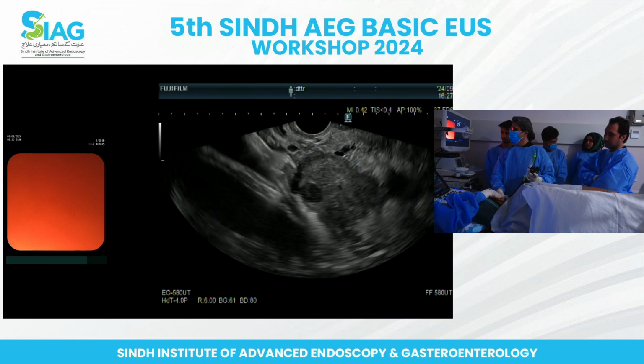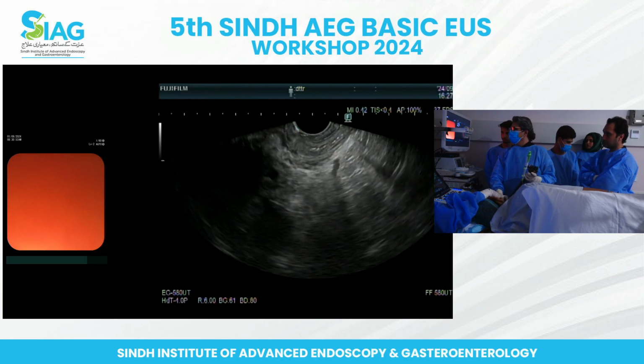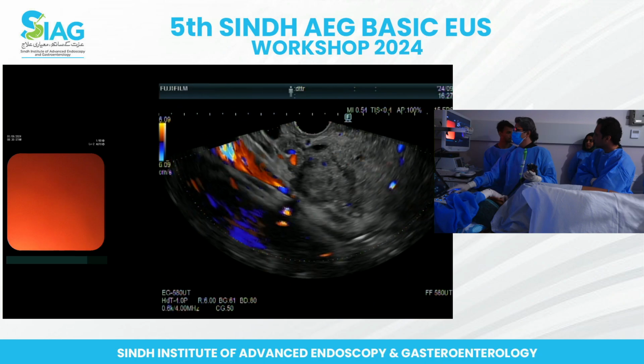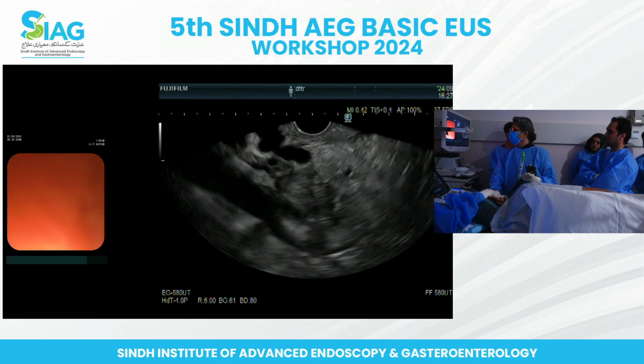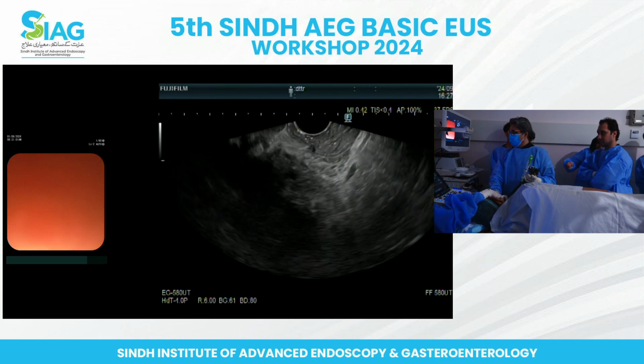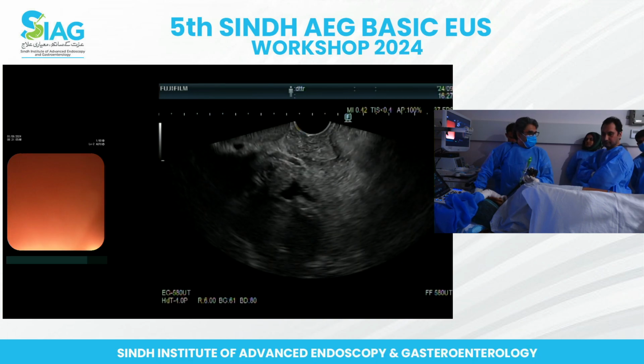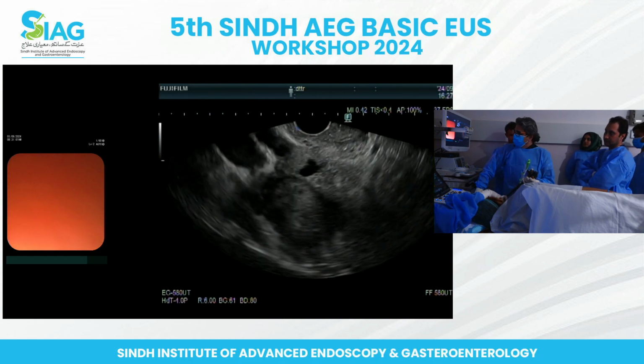And also, it's okay if it's an unstable position. If you think your tech holding the scope is going to stabilize it better for you, just do that. There's no shame or hesitancy in asking somebody to hold the scope.